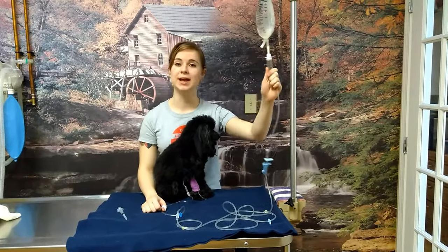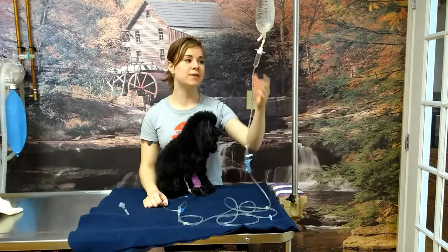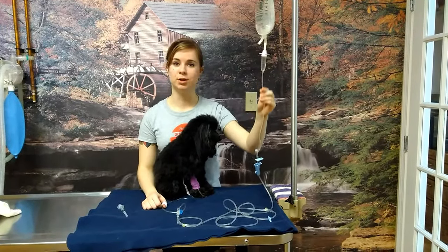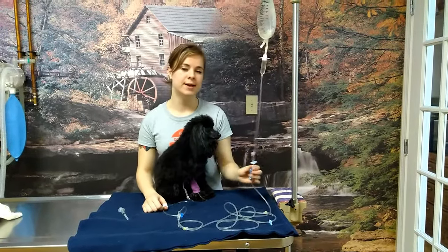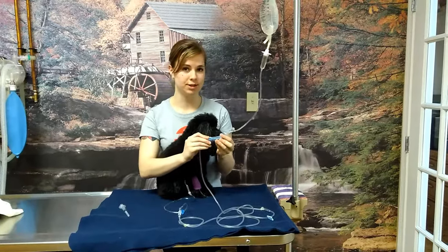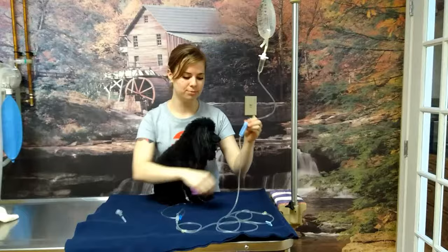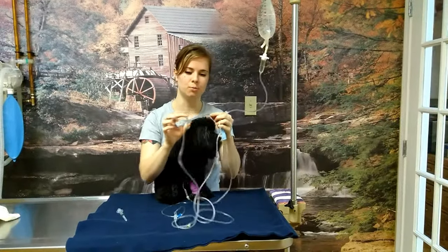Care for your pet's IV line, part 2. Sometimes you might find that the drip rate has stopped and you'll need to do a little bit of problem-solving to figure out what's going on. The first step is to make sure that everything is open — you want your roll to be all the way up and you want the pinches to be open and able to move.